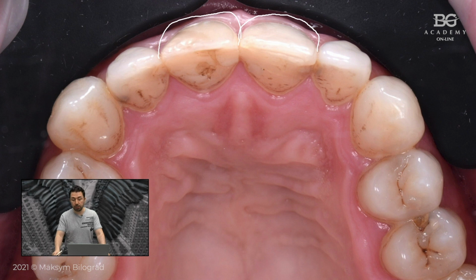And nowadays, utilizing digital workflow, digital protocols, and software like Exocad, for example, we can really plan these kinds of cases precisely. We can see virtually how much we add, how much we need to cut because of the position. We can also see the root surfaces because of the CBCT and intraoral scans that can be matched together in that software. But this case is pretty old and I just went the conventional way.